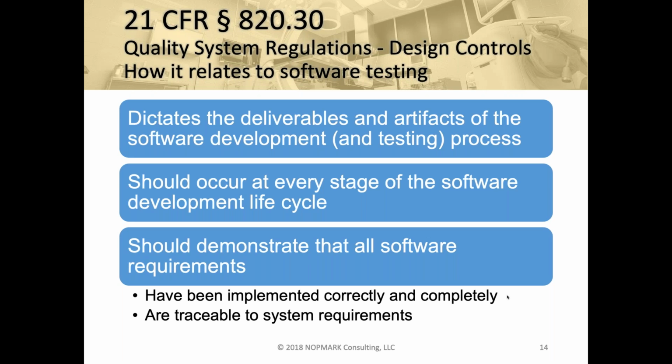Now, how much you test those requirements is driven by risk, and we can look at risk a little bit later on, but you have to show that all software requirements have been implemented correctly and completely. And part of that evidence that you provide to show that is not only your testing, but also traceability.